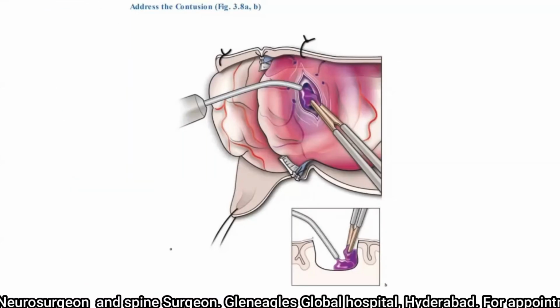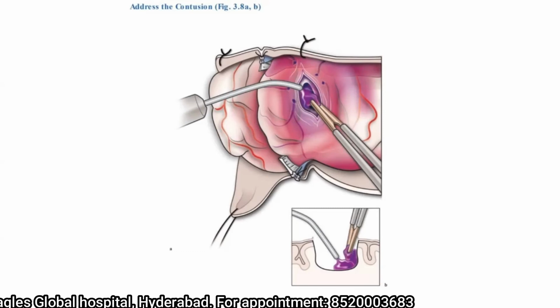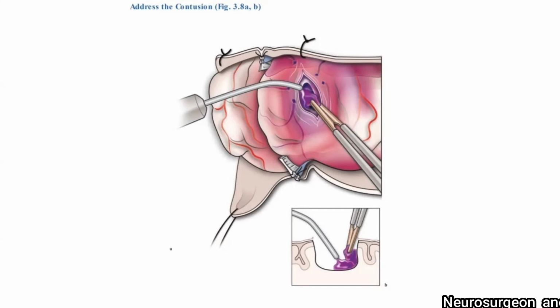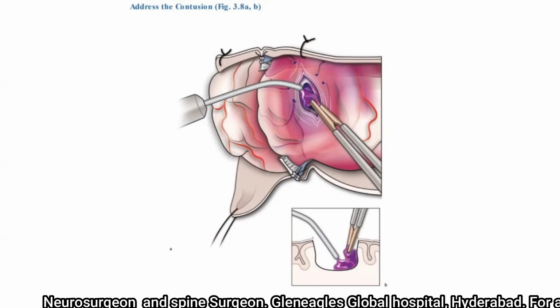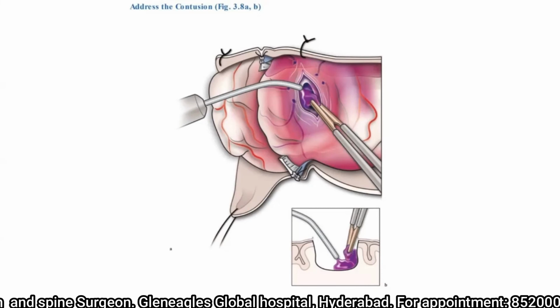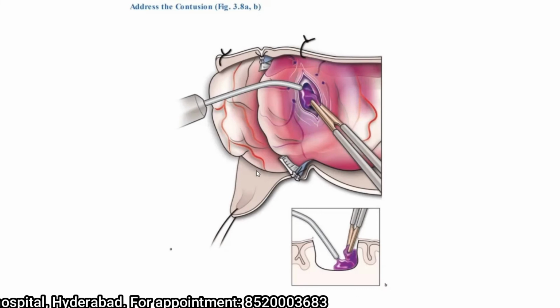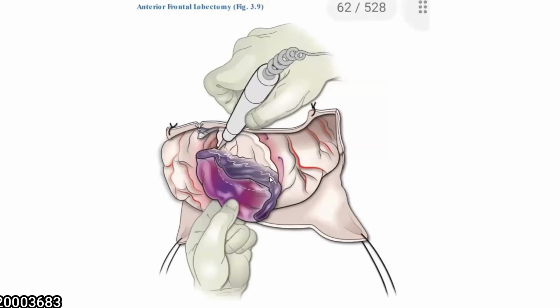Now coming to the evacuation of the contusion, this is similar to the evacuation of the temporal contusion in my previous session. So for people who have not attended my previous session, I request them to go back to my previous session on my YouTube channel. There I have clearly explained how to remove a contusion. It involves first identification of the contusion, cauterization of the superficial pial surface, then in the subpial plane, reaching the contusion, evacuating the liquid and solid components of the contusion, and achieving hemostasis.